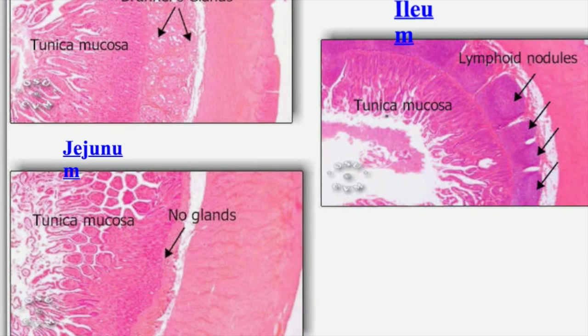Here in the ileum, we also have villi and crypts as usual, but in the submucosa we don't have glands, we don't have mucus glands. We have aggregations of lymphocytes. These lymphocytes appear as the blue dots representing their nuclei, forming these aggregations, which are blue in color, representing the Peyer's patches.